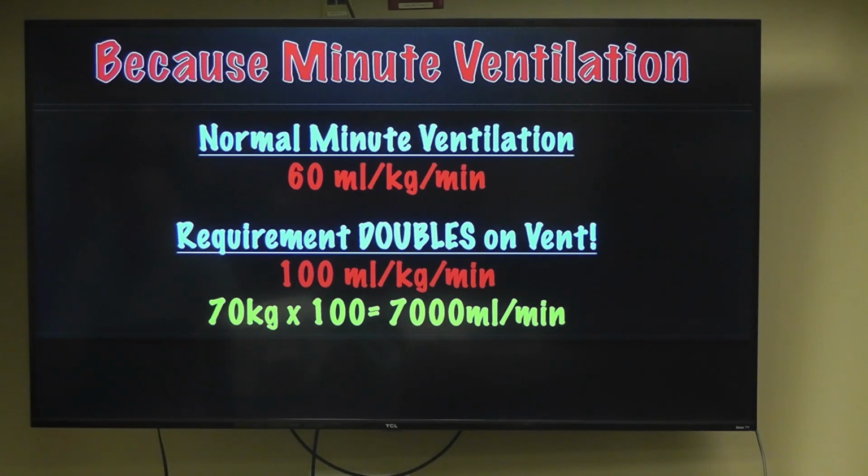And minute ventilation is something that I think we don't pay enough attention to, and people don't realize how big of an effect it has on your hemodynamics, right? You can dump 1.5 gallons of epi or Levophed as a vasopressor into somebody, and if you don't fix their CO2 and they're acidotic, it's not going to do you any good because your catecholamines don't work in an acidotic environment, okay?